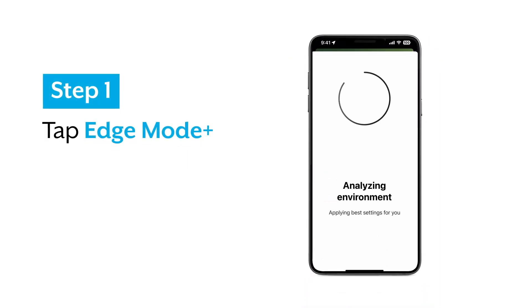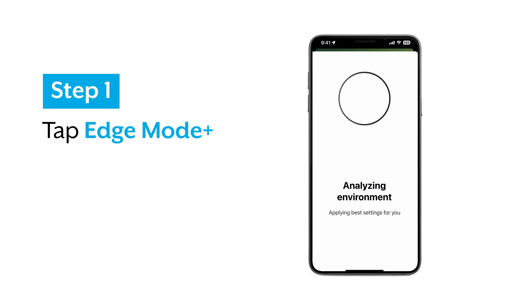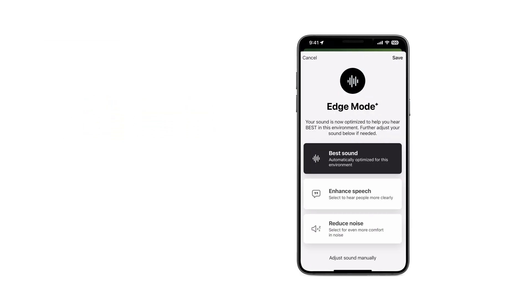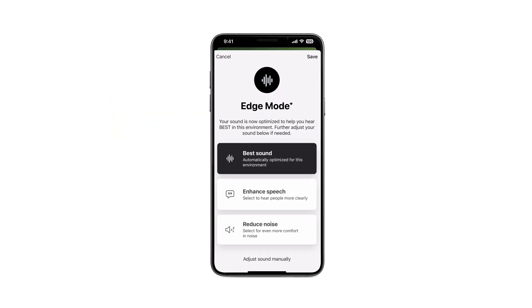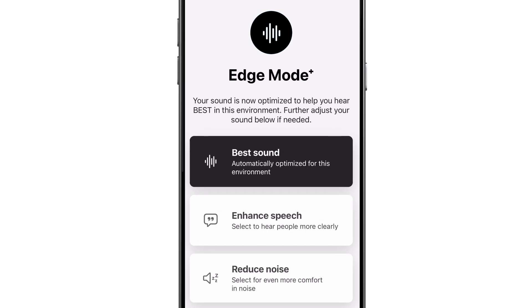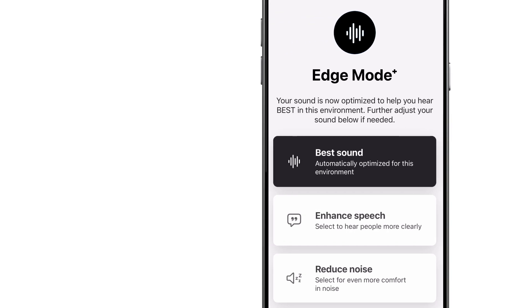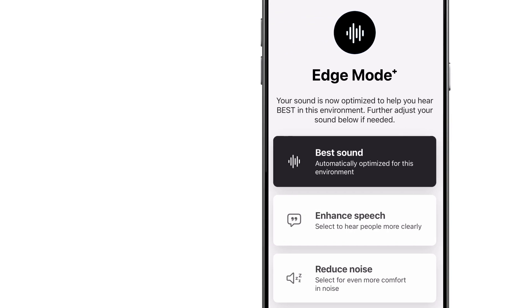Edge Mode Plus instantly scans your environment and applies the best sound setting for your needs. On your app screen, you'll see that the best sound has been applied, and you'll hear the difference through your hearing aids.